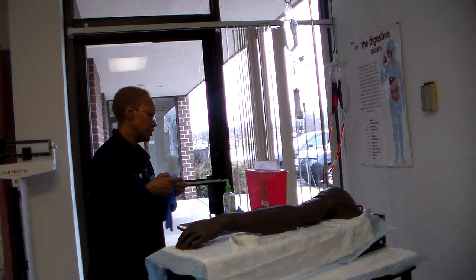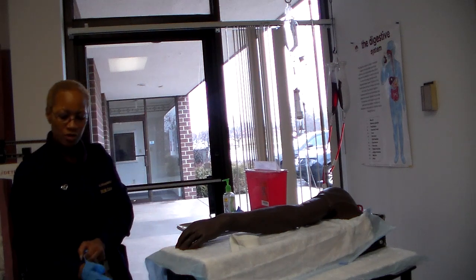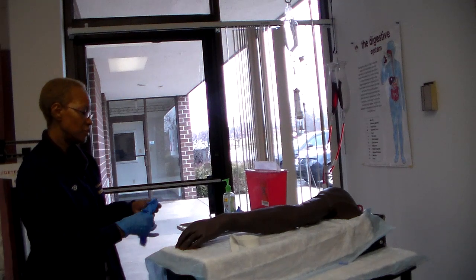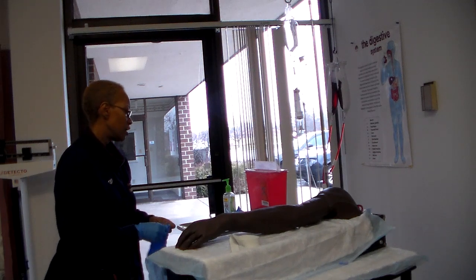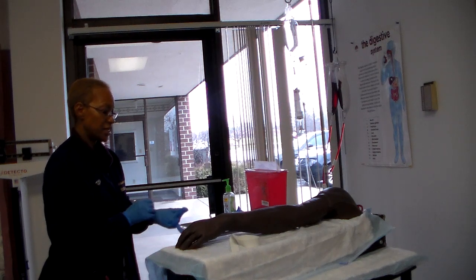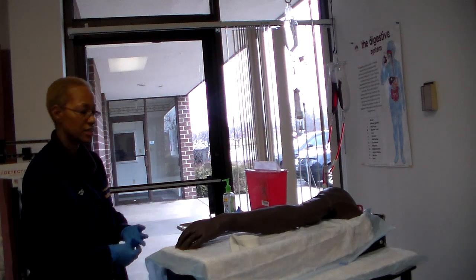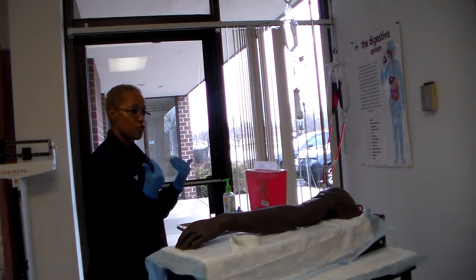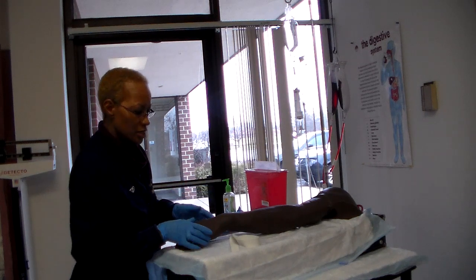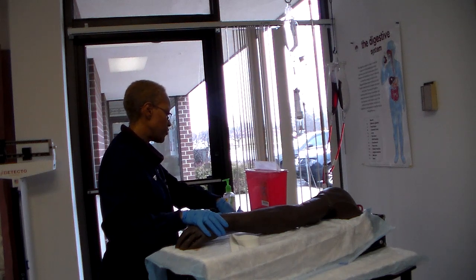So you're going to apply your gloves. If you feel you're going to be splashing, then you can put on goggles because you want to protect your eyes. So if you feel you're going to have any splashing of blood or anything like that, feel free to put on goggles or even a mask if you would like. Okay, so now I'm going to identify any accessible vein.